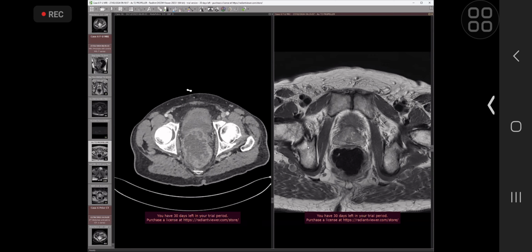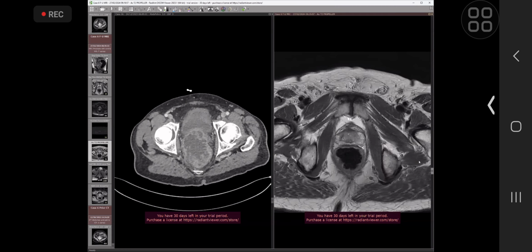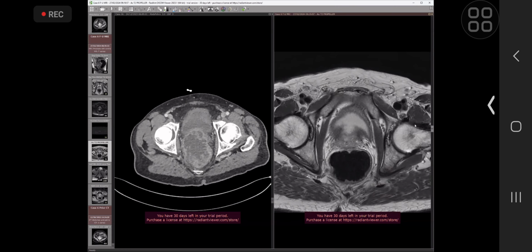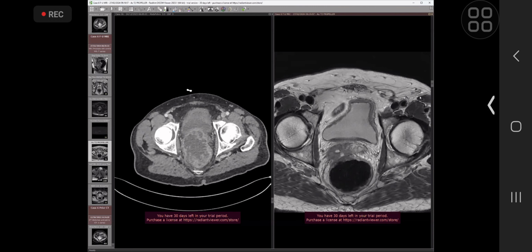Yes. So I think this is the sort of thing that you might get with prostate when it comes to the 2B examination, is an introduction with a CT. So you ended up doing the 2 cases that were like that. So either a large tumor within prostate as your first case, or something that looks quite cystic and multiloculated and could be an abscess. So you might raise that, but you would want to be sure with the clinical history, and an MRI would be the right call.